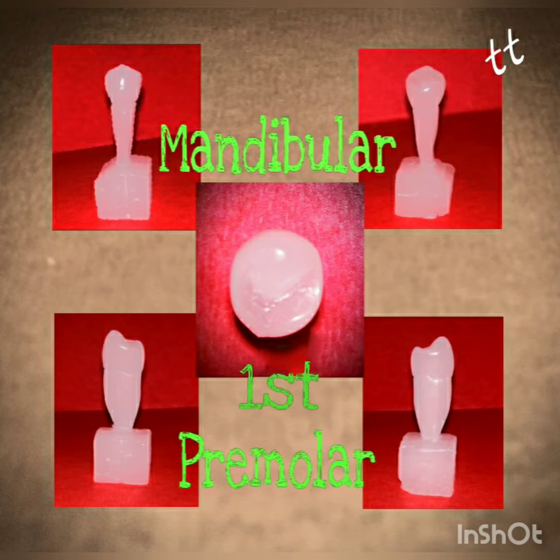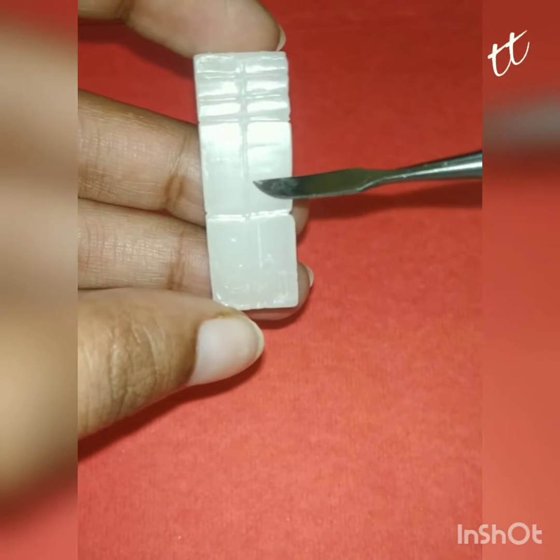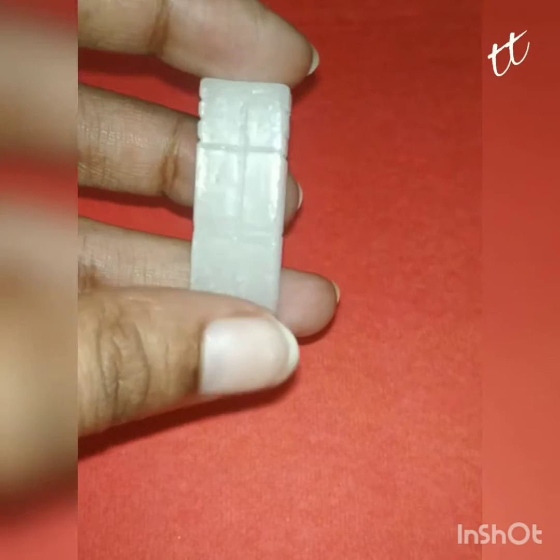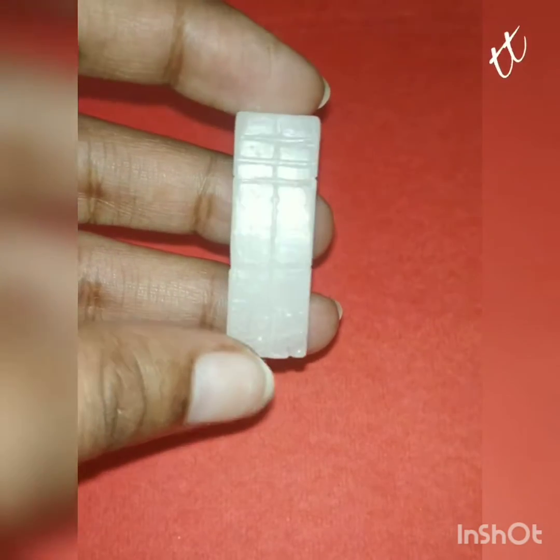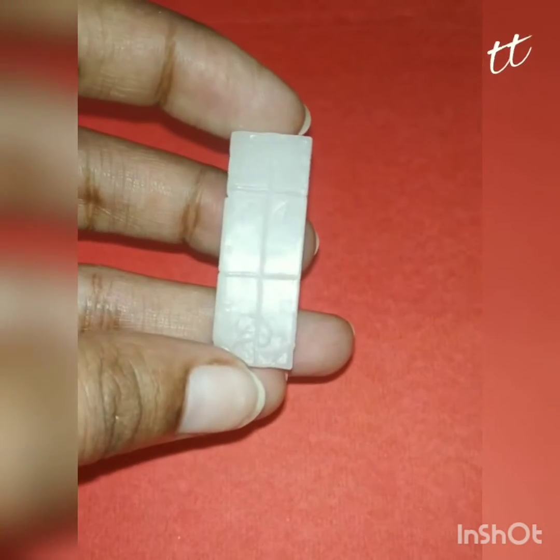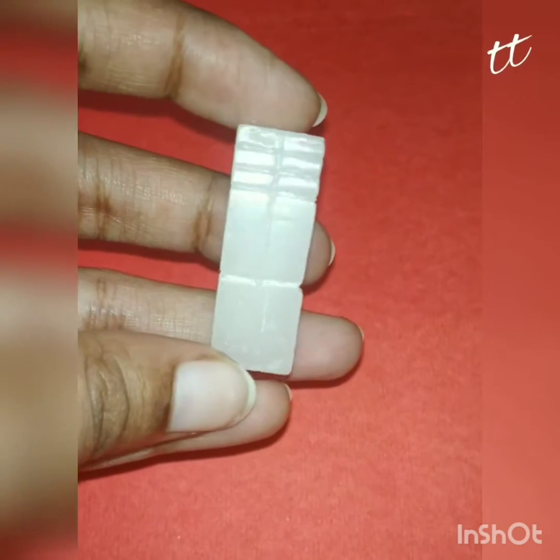Hello everyone, this video is for the carving of the mandibular first premolar. As you can see, I have a wax block and I have marked the midline on each surface, also labeled as labial, lingual, mesial, and distal.